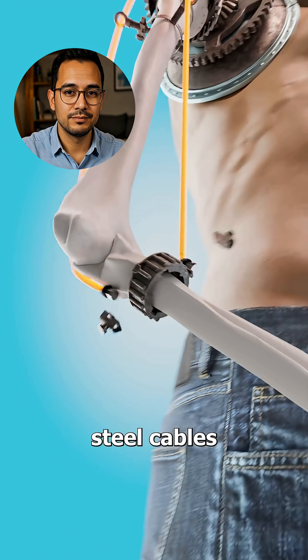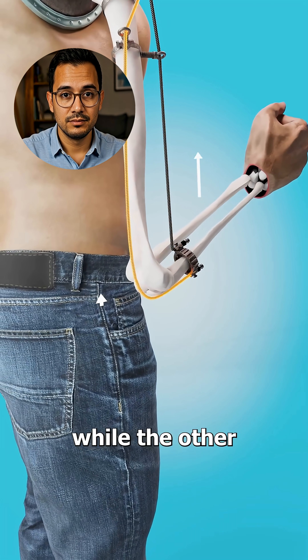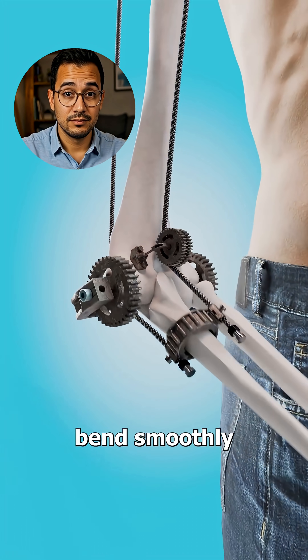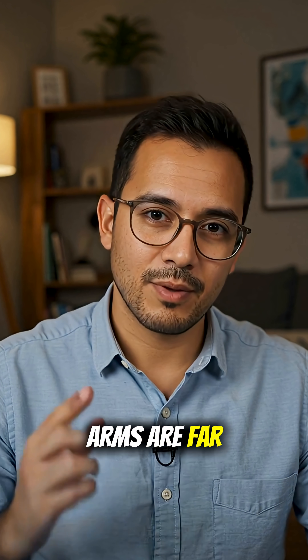At the elbow, run two steel cables like strings. The first pulls your forearm up, while the other pulls it back and down. Then add larger gears to make it bend smoothly. Again, great for animation, but real bionic arms are far more complex.